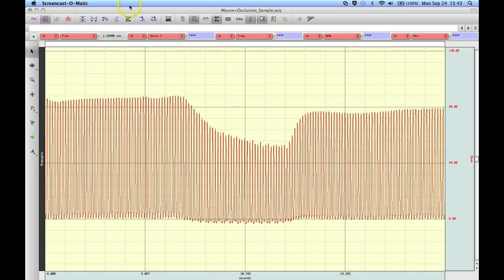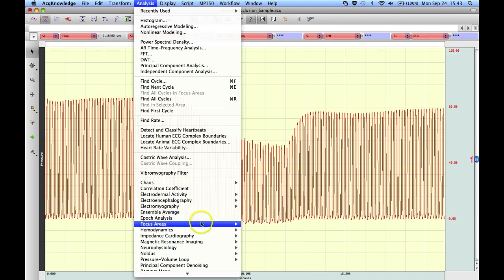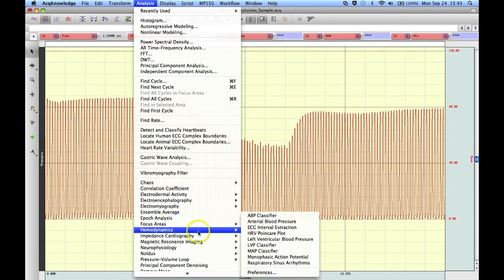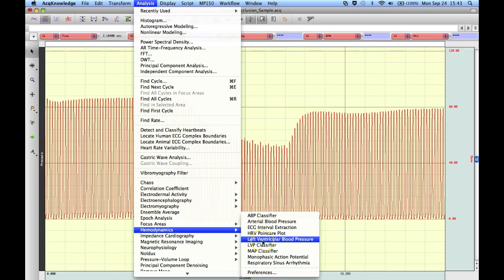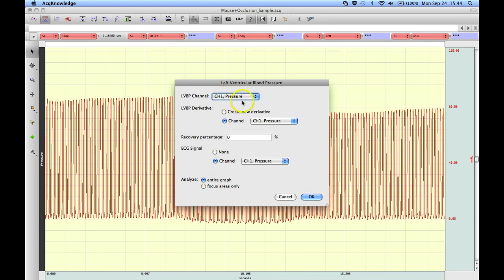To run this analysis, you go to the analysis menu, down to the hemodynamics submenu, and in there we have the left ventricular blood pressure analysis. When you select this option, you're asked to identify the pressure waveform, in this case it's channel 1.